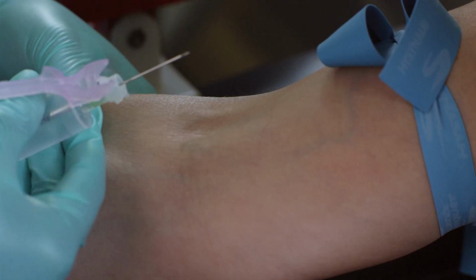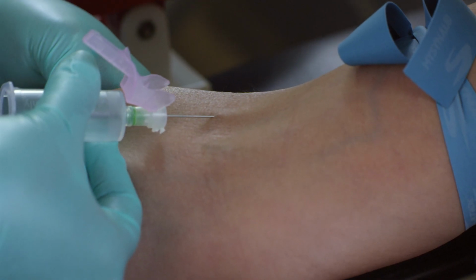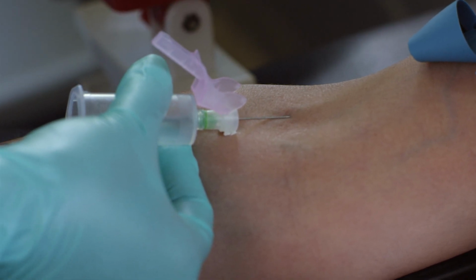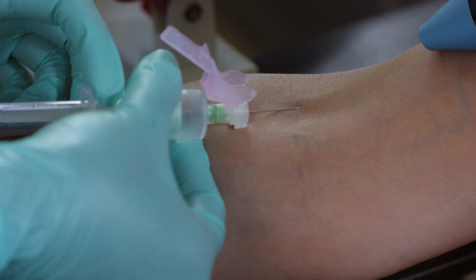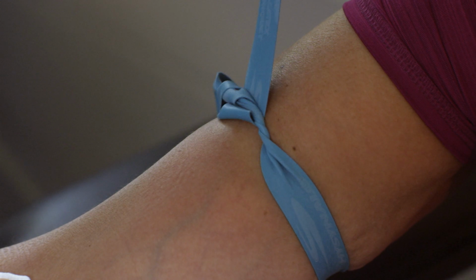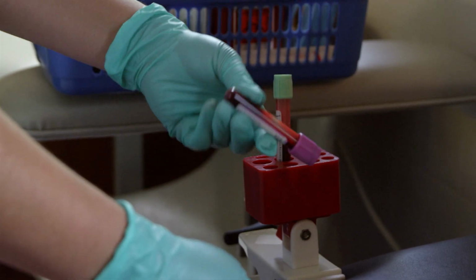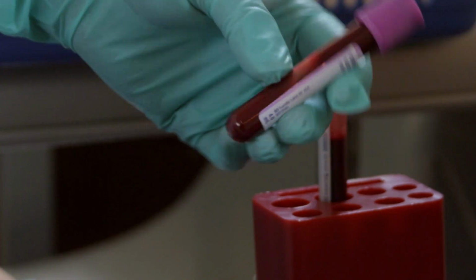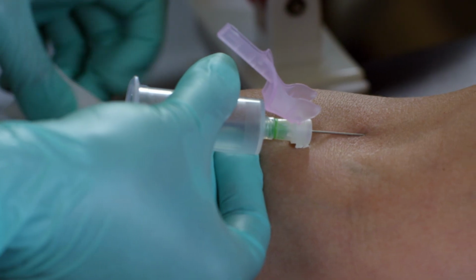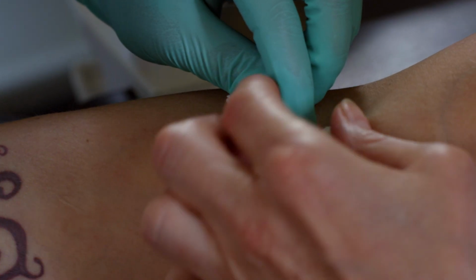Next, the vein will be anchored, and the venipuncture will take place. There may be a small degree of discomfort with this procedure. Once the blood begins to flow, the tourniquet will be released. There may be more than one tube of blood collected, depending on the number of tests required. Tubes will be mixed.